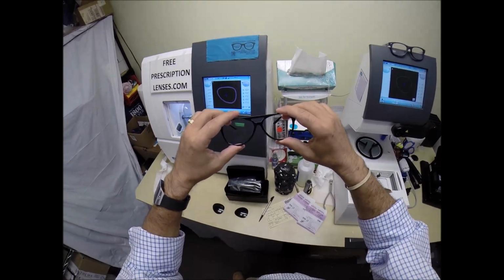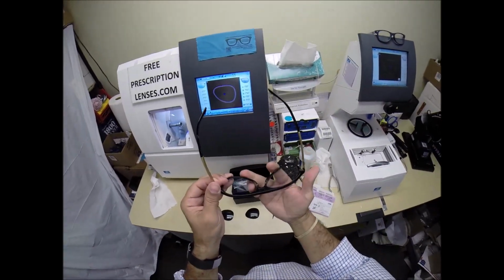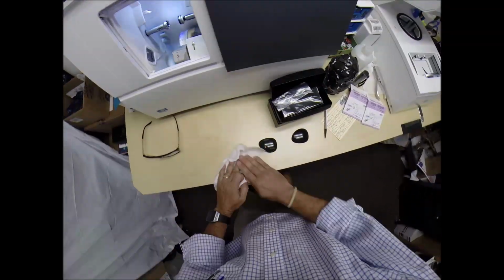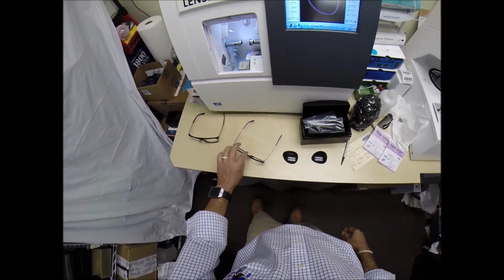But I'm gonna get these in standard alignment first, also known as a 3-point stance. The 3 points are 1, 2, and the bottom of the frame being 3. I set it on the counter and press down. There is no wobble. When I say wobble, I'm part of that 80%. When I take mine off and set them down, they wobble on the counter, but they sit level on me.